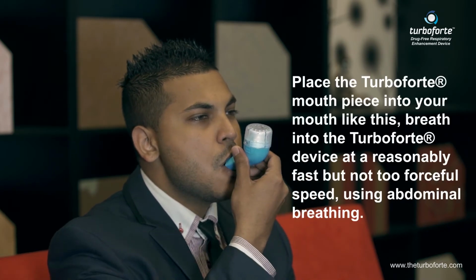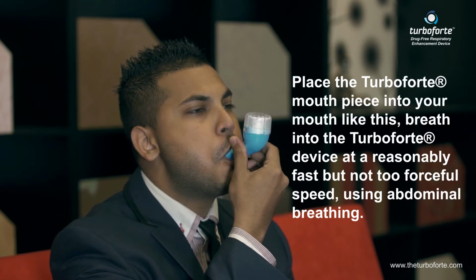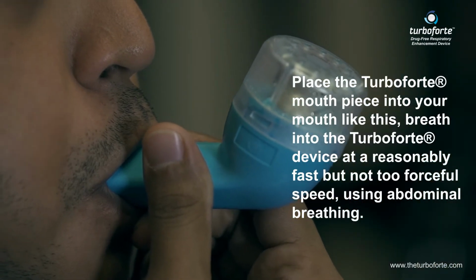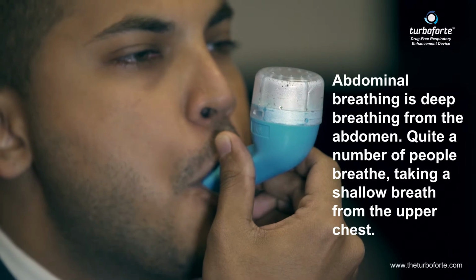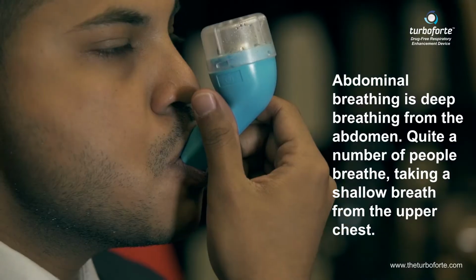4. Place the Turboforte mouthpiece into your mouth like this. Breathe into the Turboforte device at a reasonably fast but not too forceful speed using abdominal breathing. Abdominal breathing is deep breathing from the abdomen. Quite a number of people breathe, taking a shallow breath from the upper chest.